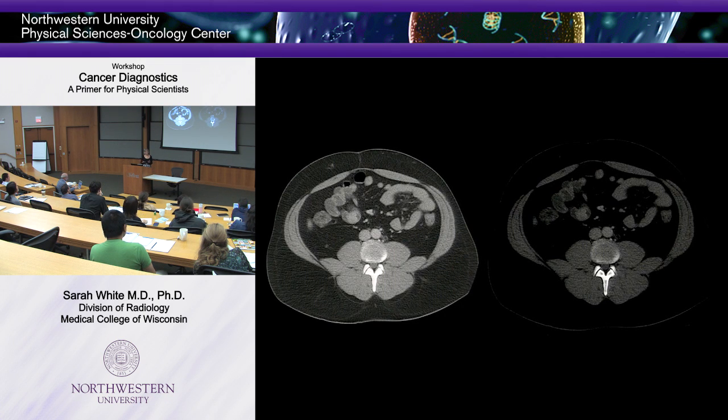So this is basically a CT scan axial image, and now we're down here, just about the middle. Does anyone see anything that looks abnormal? Now you can window these scans too, so you can make it darker or lighter just depending on what you want to look for. Does everyone see this thing? Okay, this is what water looks like in the bowel, sort of this light gray color. See this bright white dot?